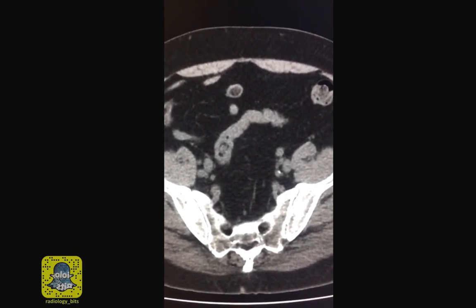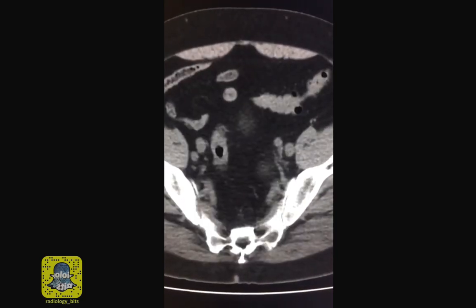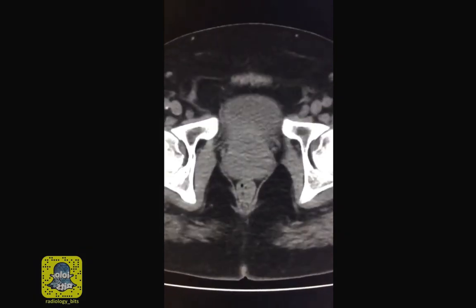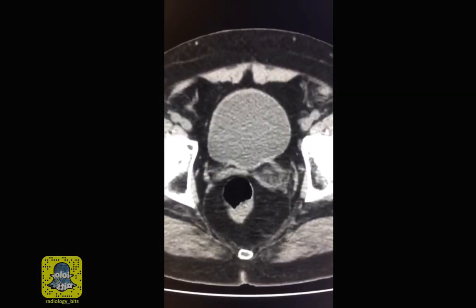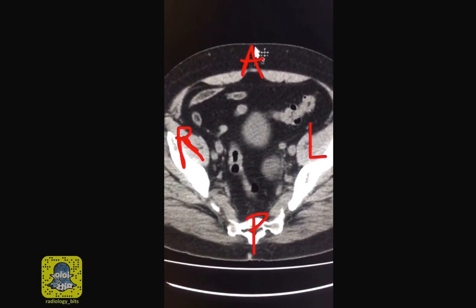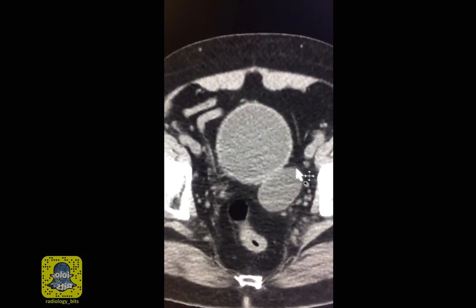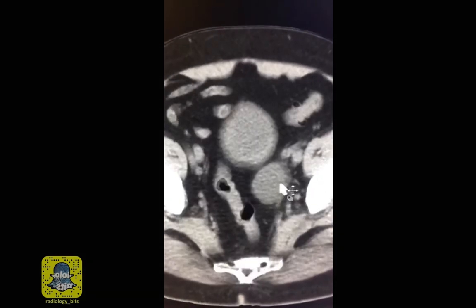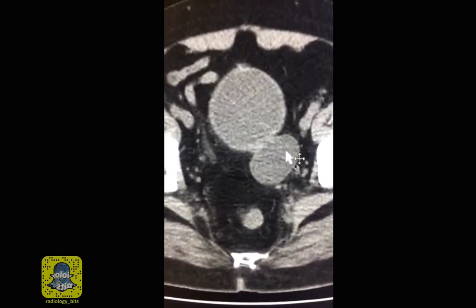This is a good case for juniors. We're looking at a non-contrast CT — this is the pelvic part of an abdominal pelvic CT. This is the pelvic bone; you're looking at the patient from his feet, so this is anterior, this is posterior, this is right, and this is left. The abnormality is this well-defined, relatively low-density structure that's adjacent to the urinary bladder. The first thing is to make sure it has no soft tissue components, and by measuring the density it's very low — consistent with fluid — so this is a fluid-containing structure.